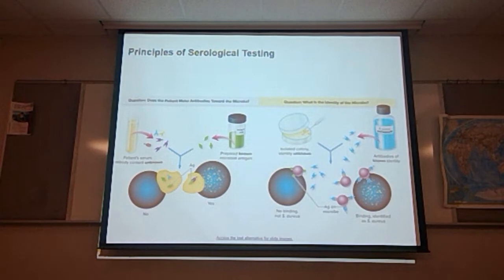And here's a couple of examples of different types of serological testing. You take a sample, you put it in with the known antigens. If there is no antigen complex here, then you get no reaction. But here you see the antigen and the antibody. They are coming together here, so you get a reaction shown over here as the agglutination reaction.